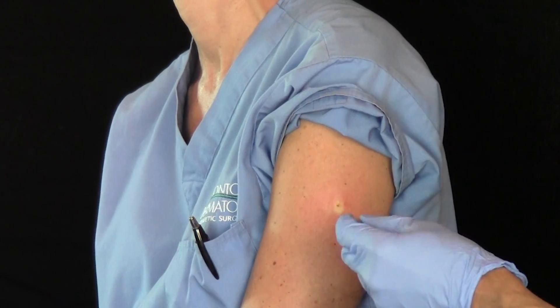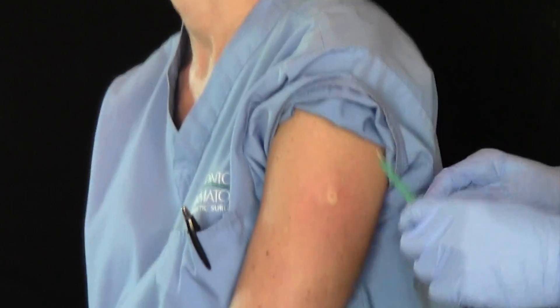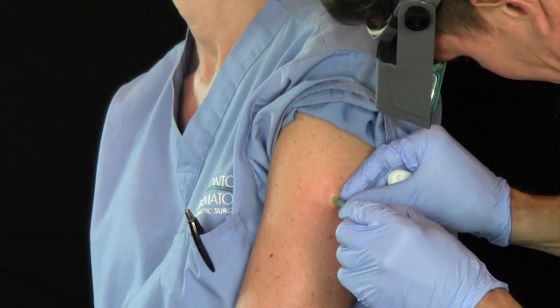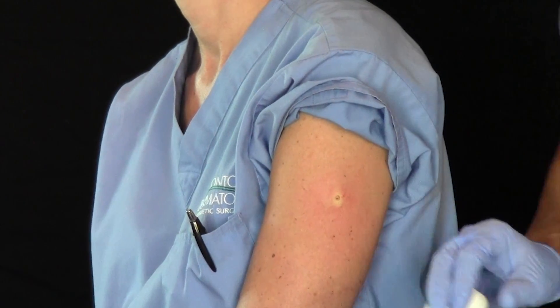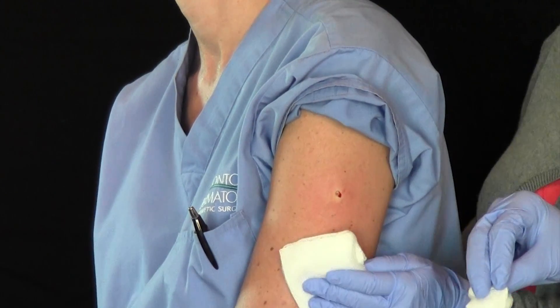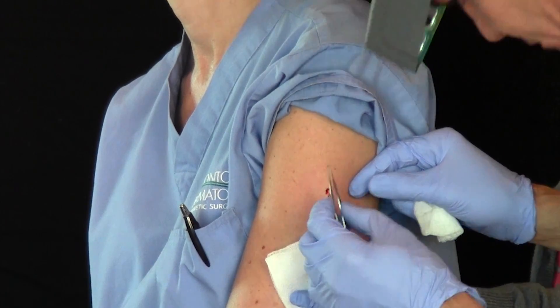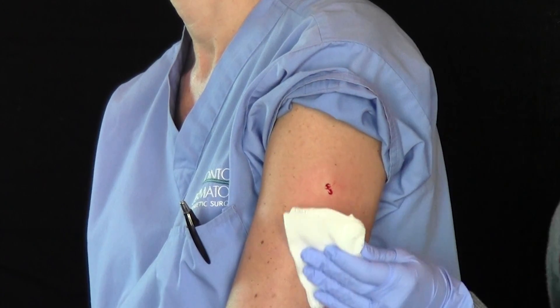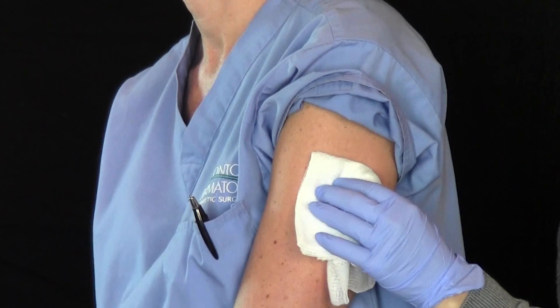Now we just take this little — I call it a little cookie cutter type punch — and we put it on the lesion. We twist it and the skin is then free to come out. So we pull that out. We send this specimen off to the lab and they'll tell us if there's anything unusual about this.